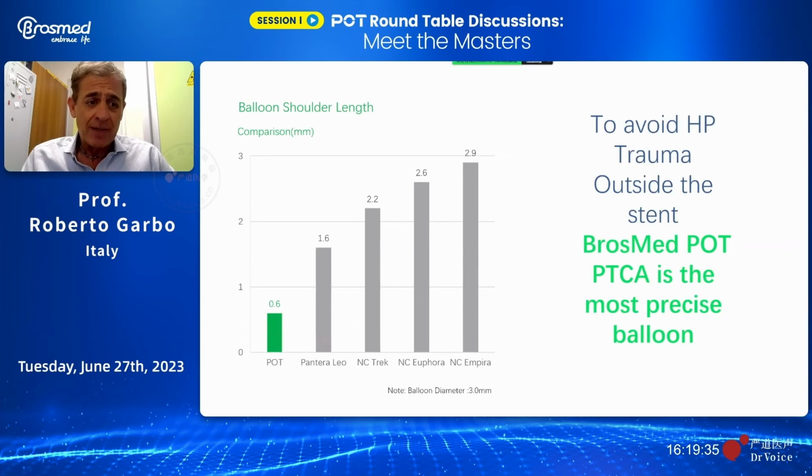So we are talking about POT as post-dilatation inside of the stent. We have a really precise positioning of the device.